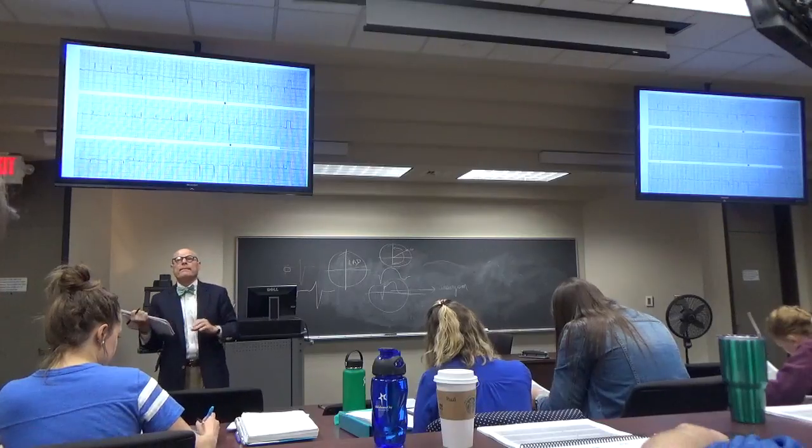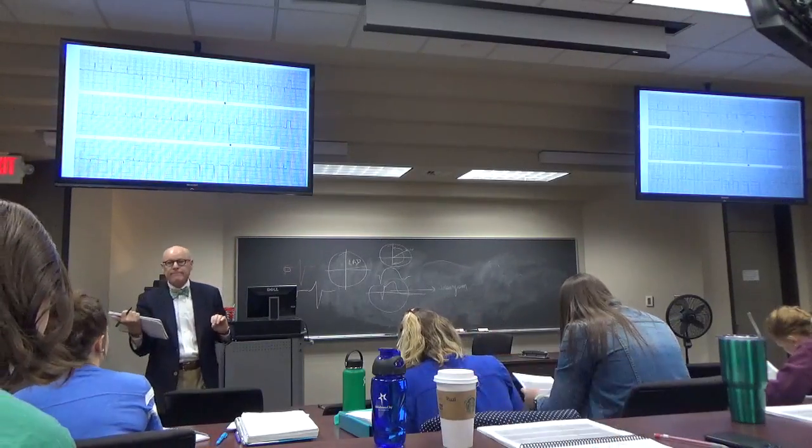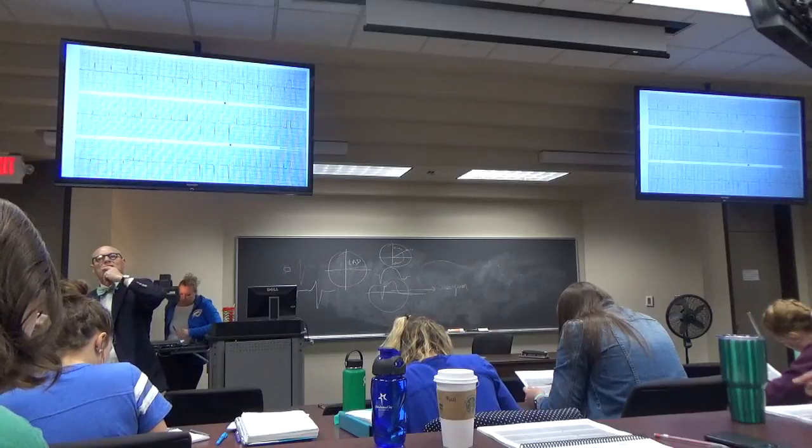I don't know if you said, I put left atrial enlargement. I don't know if I'm right. Well, it's a biphasic P wave up there. Yeah. Okay. Another question?